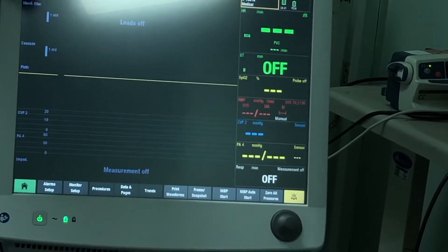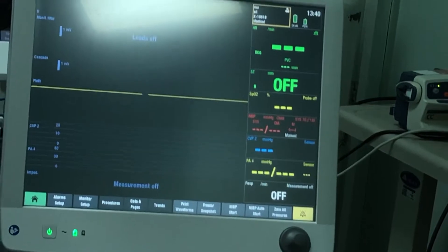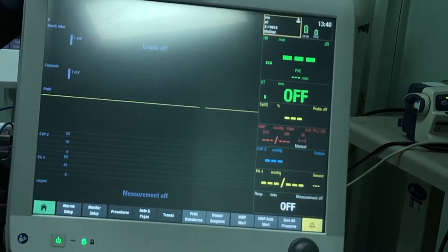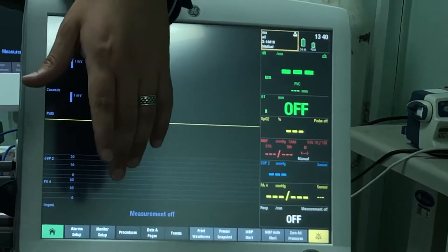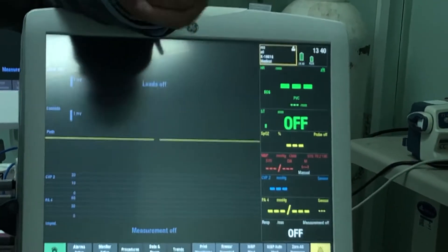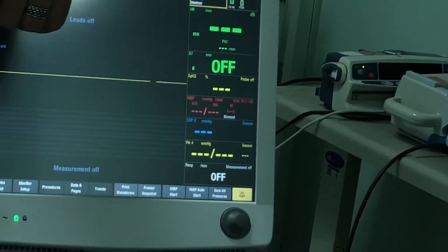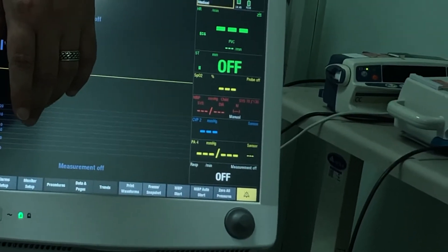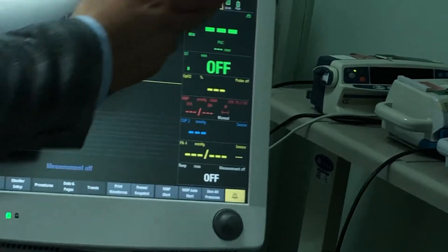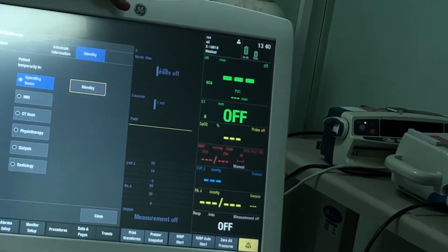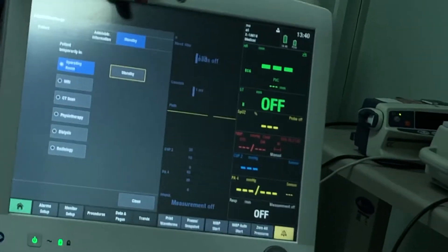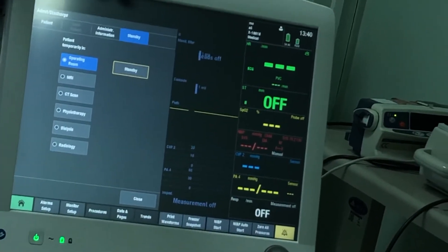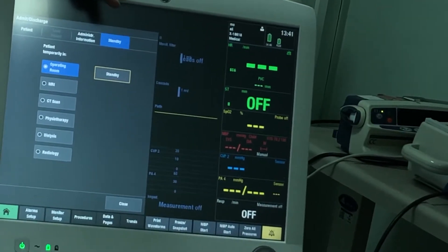Even if you have a patient connected to the monitor and you want to put the monitor on standby so it won't alarm — maybe you want to do morning care, positioning, or change the leads — once you disconnect the patient the monitor will keep alarming. If you don't want that, just put the monitor on standby. Whether you're taking the patient for a blood test, to the bathroom, or for a walk, just put the monitor on standby so it will not alarm while the patient is away.